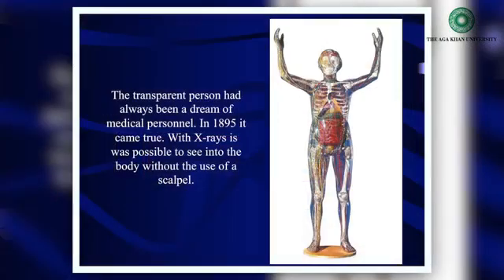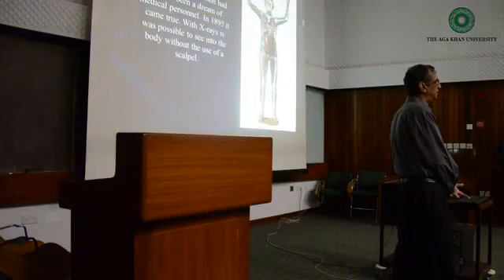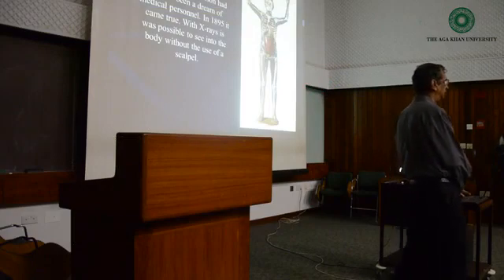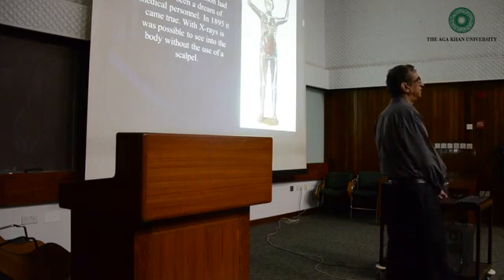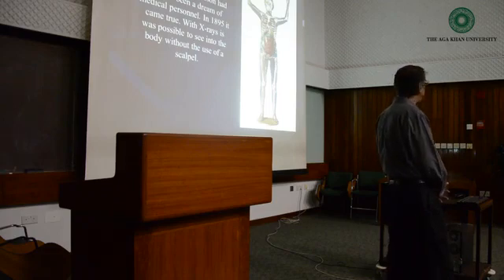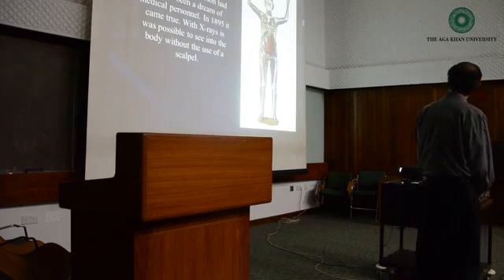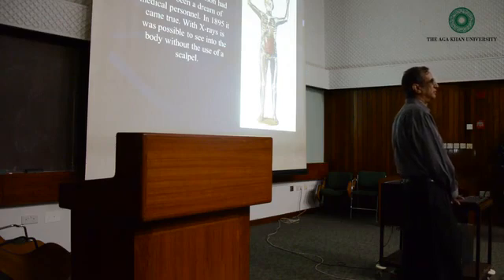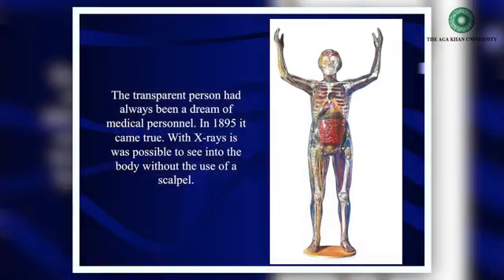So as I told you, a transparent person: that could only be when you can see inside. Clinically, if you examine a patient, you are seeing from outside. A stethoscope allows you to hear the heart, the peristalsis in the abdomen or breath sounds, but you can't image inside. So first there were X-rays, then CT scan was developed, then ultrasound and magnetic resonance imaging. Nowadays, instead of X-rays, it is sometimes called just medical imaging.